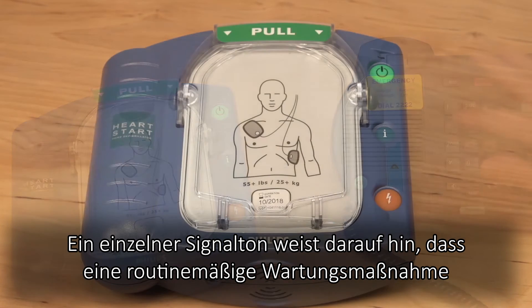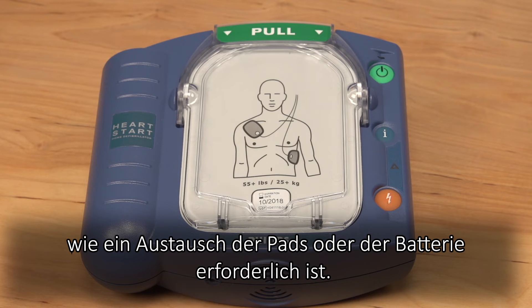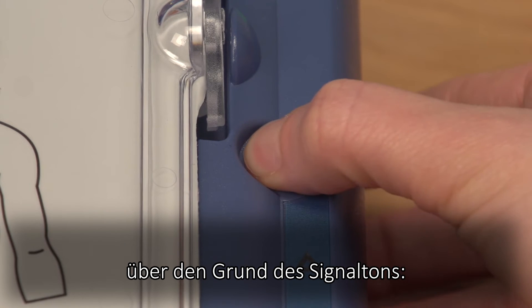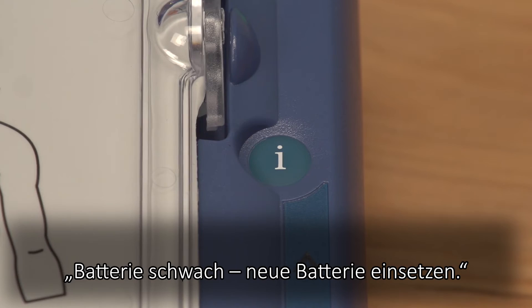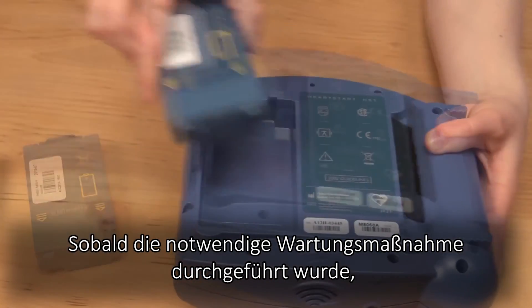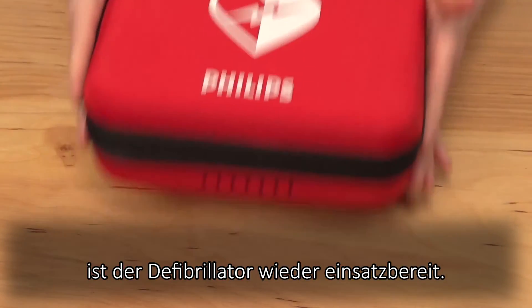A single chirp indicates that the defibrillator requires routine maintenance such as replacement of pads or installation of a new battery. Press the flashing blue eye button to hear additional information about the cause of the single chirp, for example: "Low battery. Insert fresh battery." Perform the necessary maintenance to resolve this issue and return the defibrillator back into service.